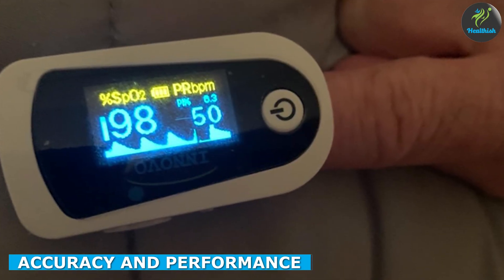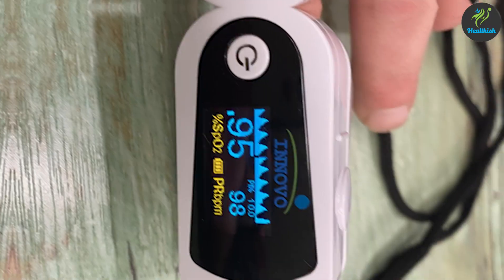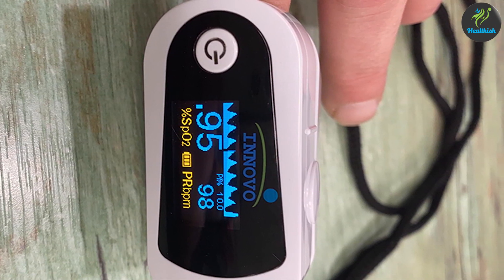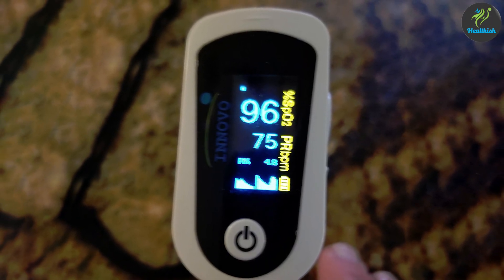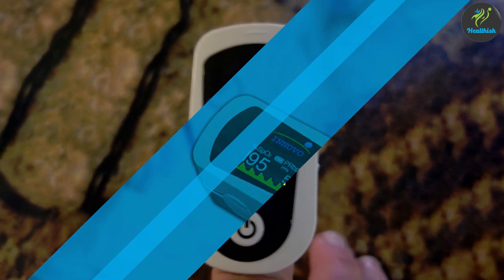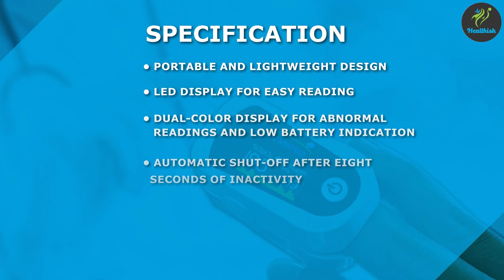Accuracy is of utmost importance when it comes to pulse oximeters. The Innovo IP900BP is known for its reliability and precise measurements. It employs a high-quality sensor that rapidly detects your SPO2 levels and pulse rate. However, it's important to note that readings can be affected by factors such as cold fingers, nail polish, or excessive movements. For the most accurate results, ensure your finger is clean, warm, and properly positioned within the device.